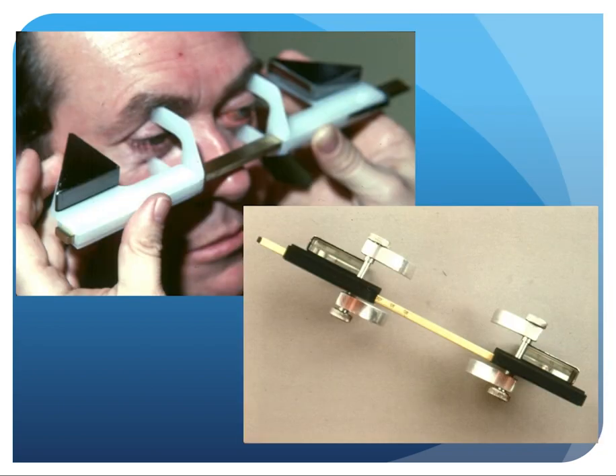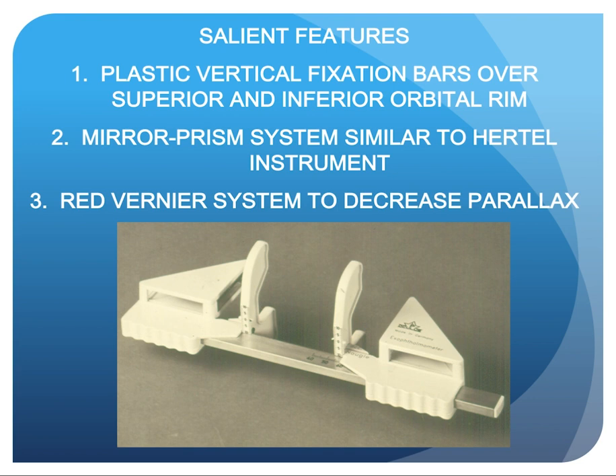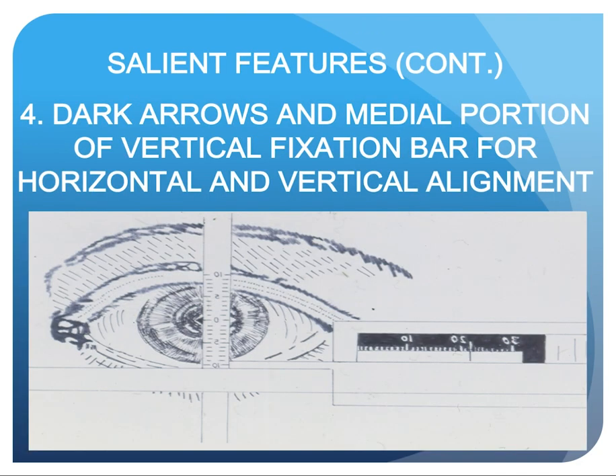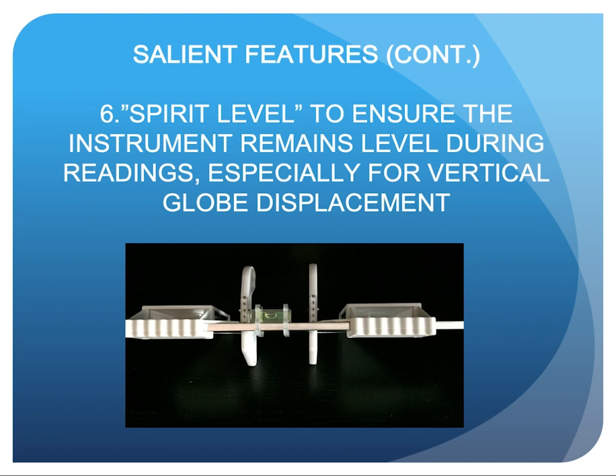These are two earlier prototypes and the current instrument. The salient features of our instrument are: plastic vertical fixation bars over the superior and inferior orbital rim; a mirror-prism system similar to the Hertel instrument; a red vernier system to decrease parallax; and dark markings on the medial portion of the vertical fixation bar aligned in the mid-pupil for horizontal and vertical alignment. There is also a vertical gradient scale for measuring hyperophthalmos and hypophthalmos.